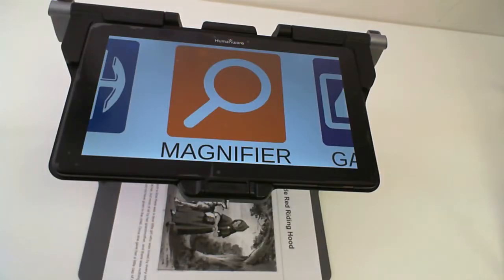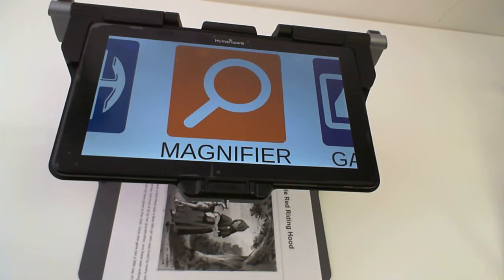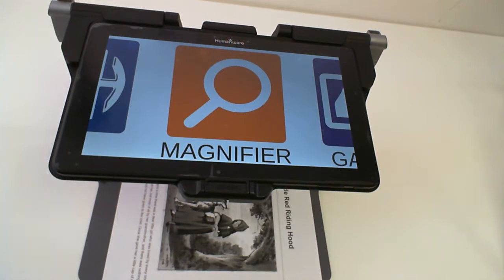Hello and welcome to this tutorial. My name is Eric Beauchamp. I am the Low Vision Product Manager here at HumanWare. In today's tutorial, we will look at the new simplified user interface available on your new MATT Connect.